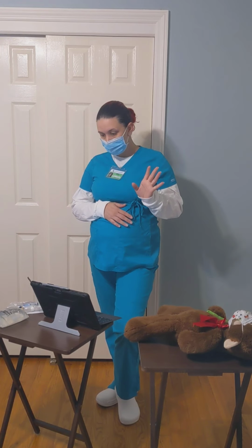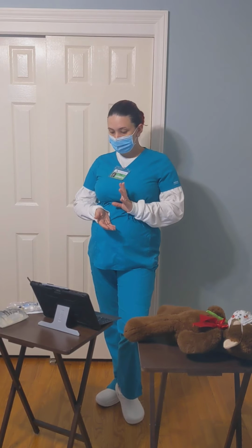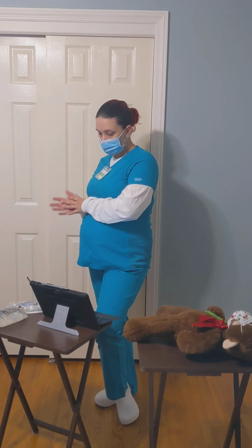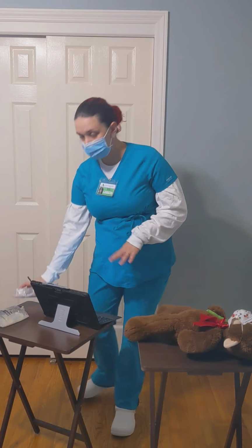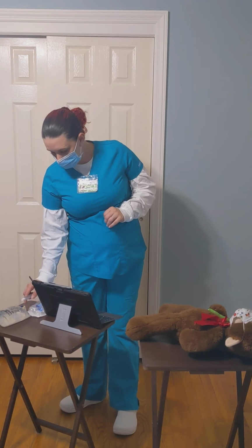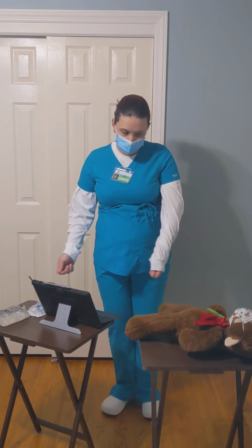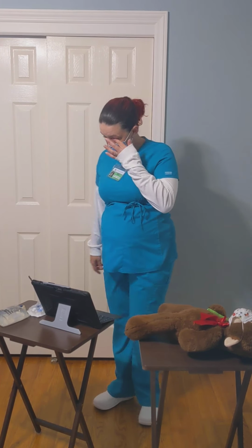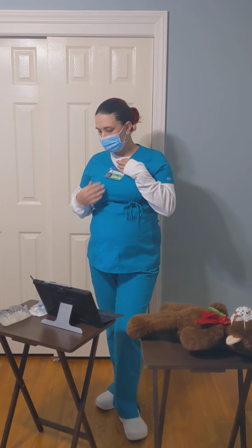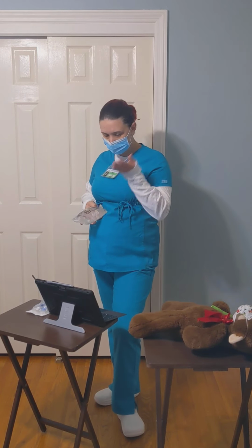Okay, so I've checked the medication order and the patient's allergies. I know why she's getting the medication. I'm going to wash my hands, and I'm going to go gather supplies. I'm going to go to the supply room and get my tubing, flush, alcohol pads. I'm going to get my med cart, bring it outside my patient's room, access the med cart, and I'm going to pull the medication and confirm this is the right medication with the MAR order.